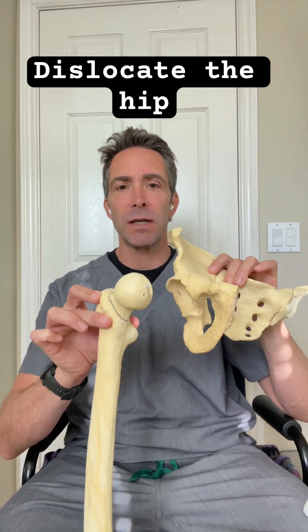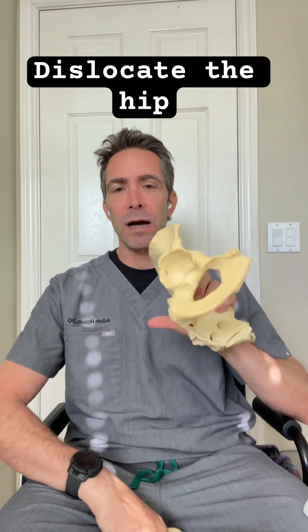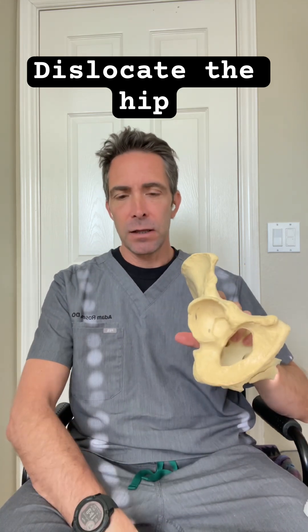So when we replace a hip, the first thing that we're actually going to do is dislocate the hip at the time of surgery, which removes the ball out of the way and allows us access to the socket. The next step is to prepare the socket — we remove bone spurs and do what's called a reaming to make that a true hemisphere.